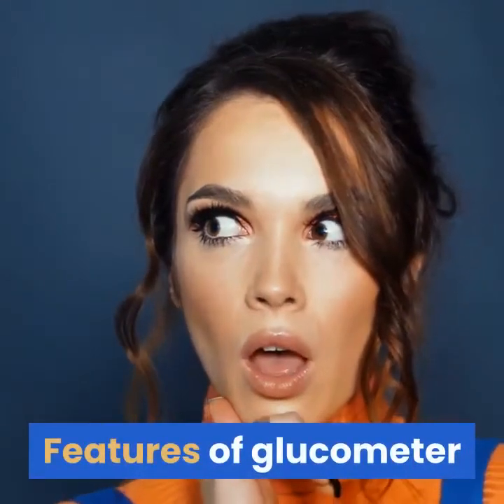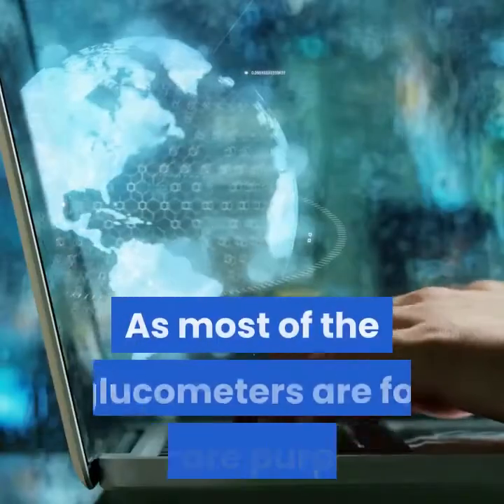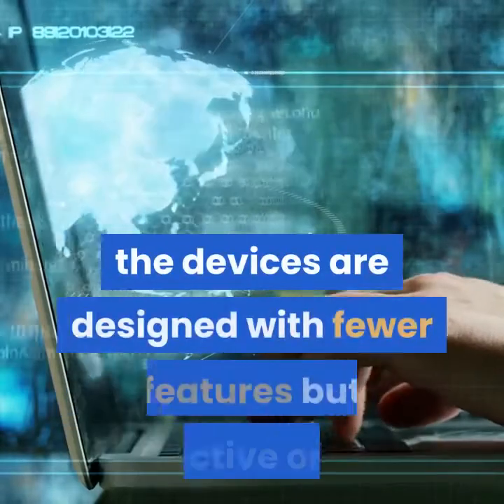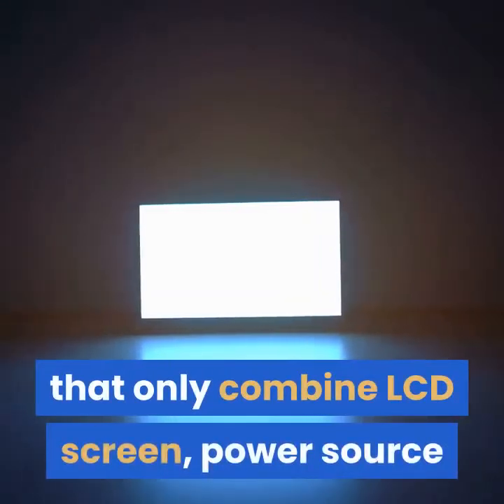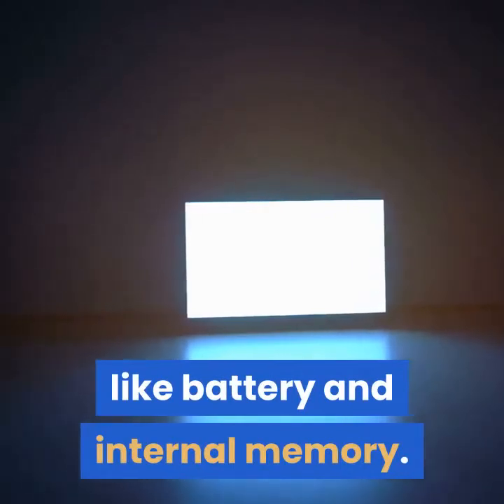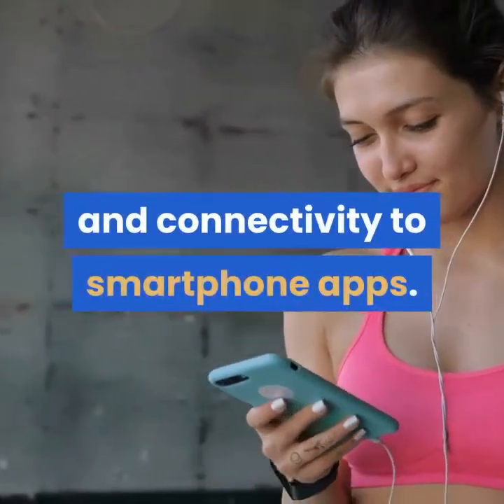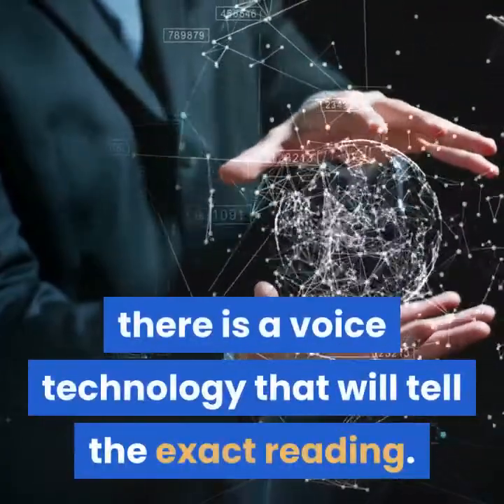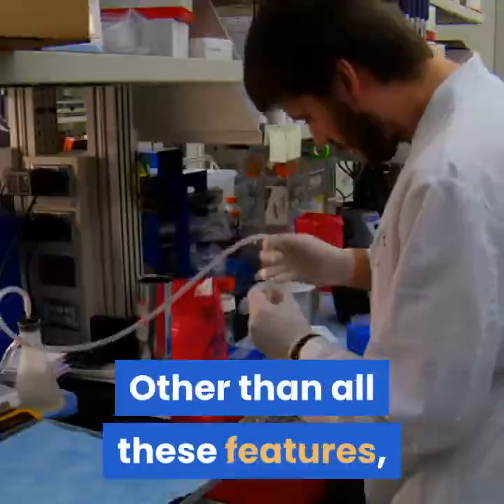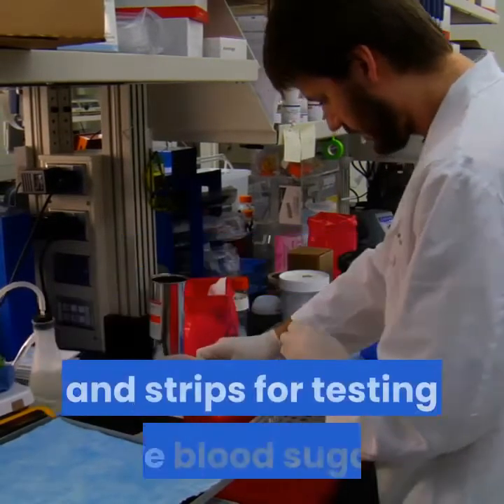A good glucometer is simple to use and easy to understand. As most glucometers are for self-care purposes, the devices are designed with fewer but effective features. Simple digital glucometers combine an LCD screen, a power source like a battery, and internal memory. Advanced devices can include Bluetooth technology, connectivity to smartphone apps, and even voice technology that reads out the exact result. The two most important components of a glucometer are the lancet and the strips for testing blood sugar.